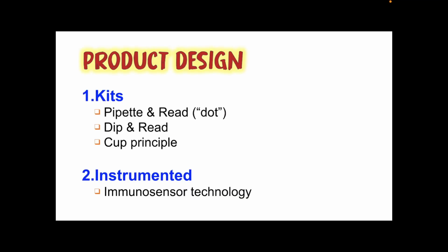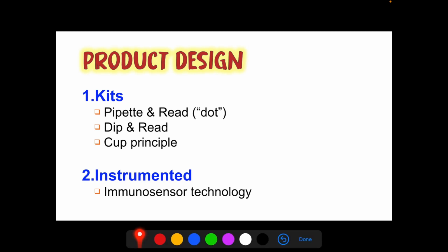Next one, for product design, we have kits and instrumented. The kits are commonly used. We have pipette and read, the dot method, dip and read, and then the cup principle. For instrumented, we have immunosensor technology.